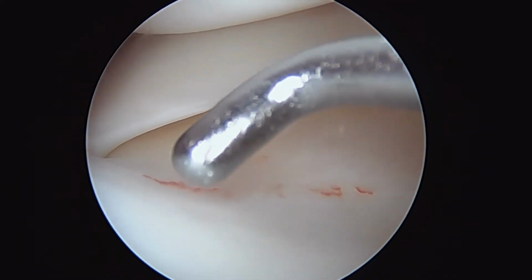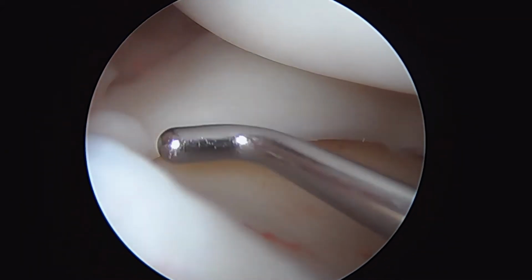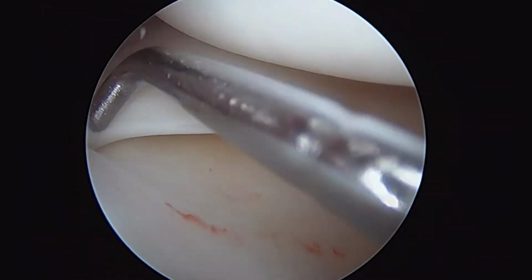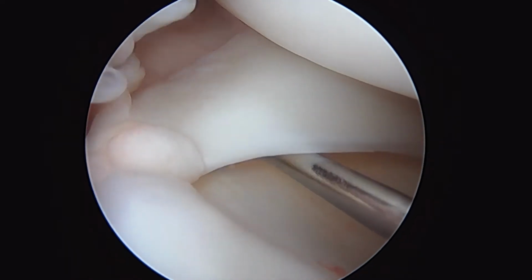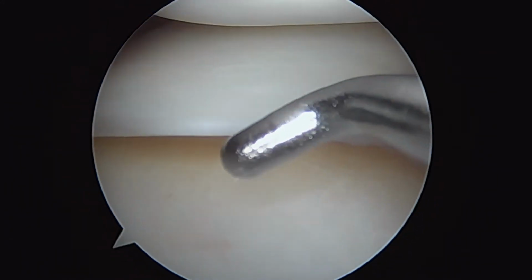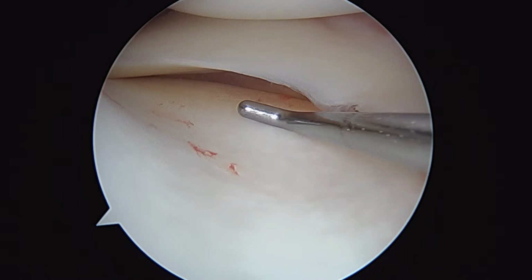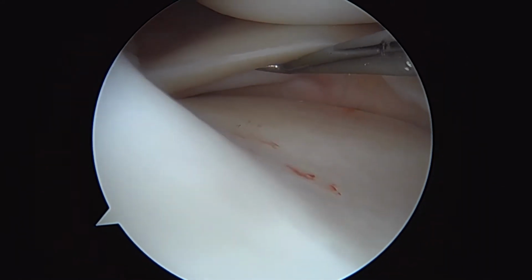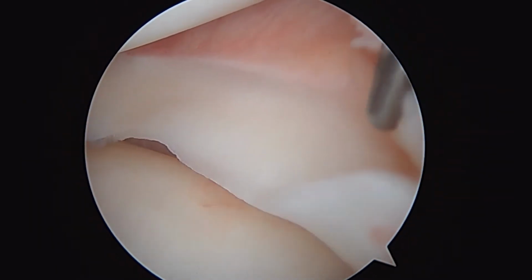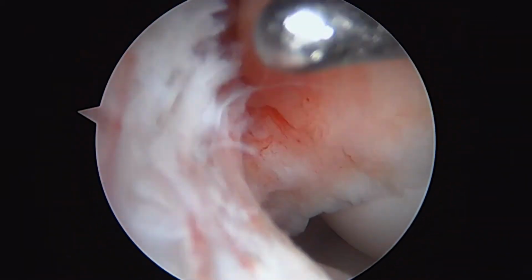We're just getting started on the right leg. We're looking in the medial compartment. This is the posterior horn of the medial meniscus. That looks very good. No signs of any significant tearing here, so that is encouraging. We'll look at the body and anterior horn, and that all looks good. The articular surfaces look great. We'll take a quick peek at the torn ACL.